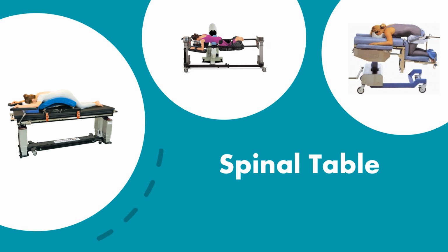The lower body, depending on what type of positioner is going to be used, is resting on the OR table or whatever positioning device is being used at the time. All right, and then we want to make sure that the toes are free, that they are not resting on the OR table.